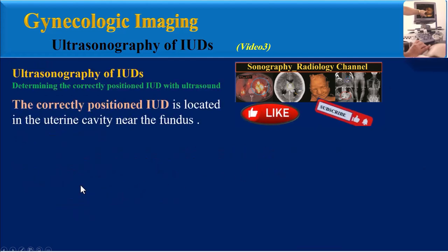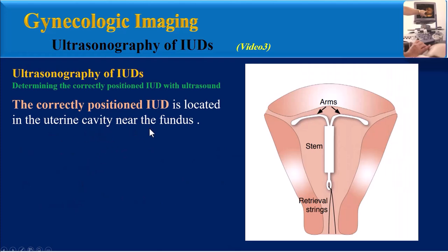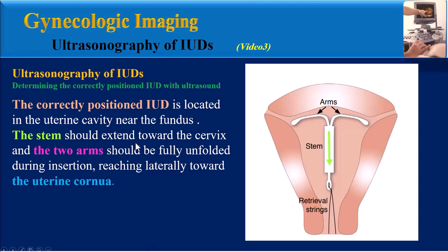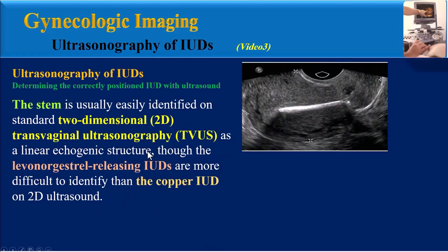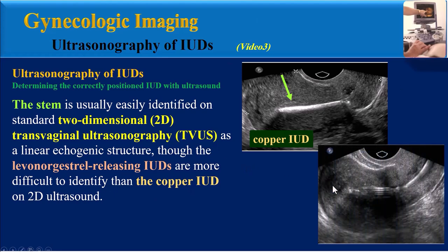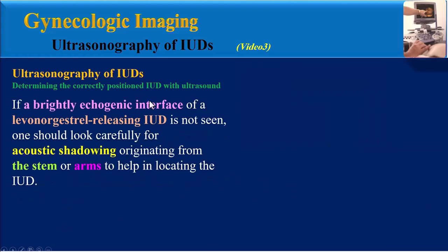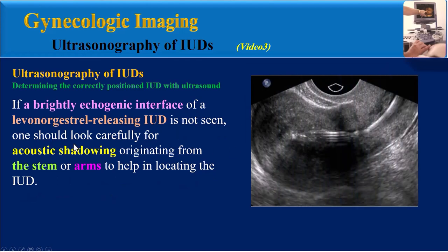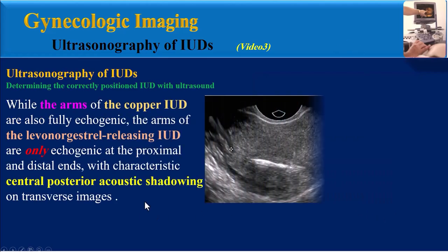The correctly positioned IUD is located in the uterine cavity near the fundus. The stem should extend toward the cervix, and the two arms should be fully unfolded during insertion, reaching laterally toward the uterine cornua. The stem is usually easily identified on standard 2D transvaginal ultrasonography as a linear echogenic structure. Mirena IUDs are more difficult to identify than copper IUDs on 2D ultrasound. If a brightly echogenic interface is not seen, one should look carefully for acoustic shadowing originating from the stem or arms.